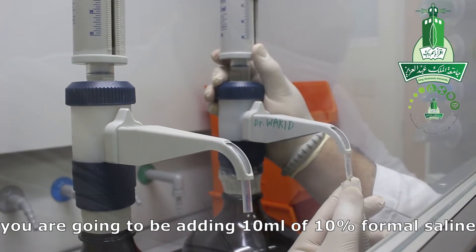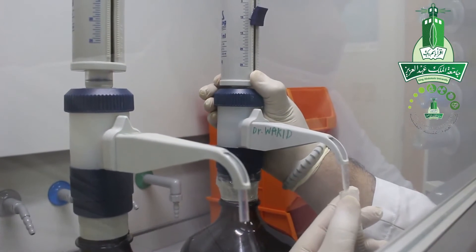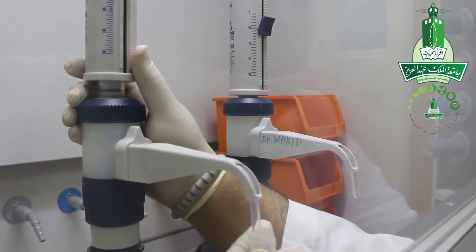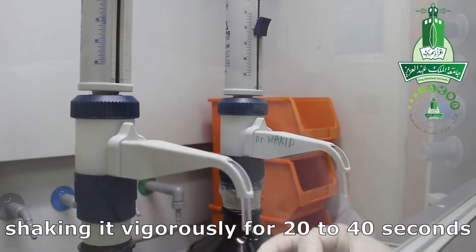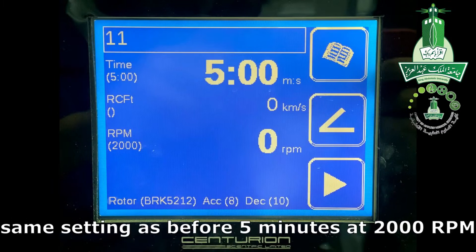You are going to add 10ml of 10% formal saline and 3ml of diethyl ether. Close your tube very well and start shaking it vigorously for 20–40 seconds. Then move to the centrifuge with the same settings as before: 5 minutes at 2,000 rpm.